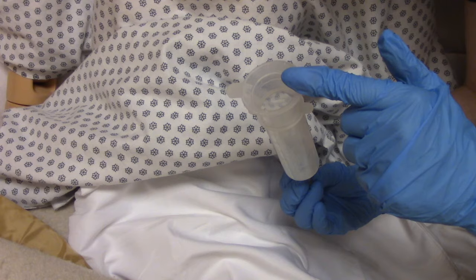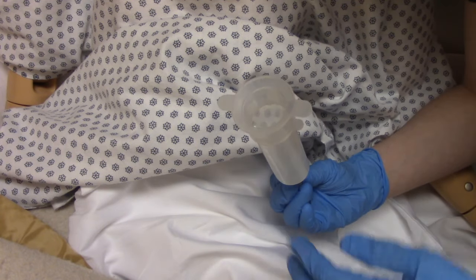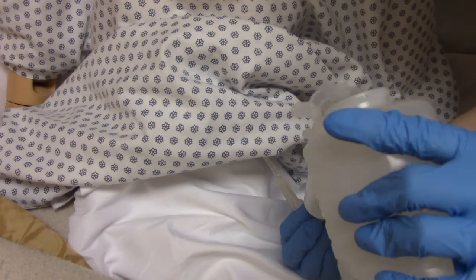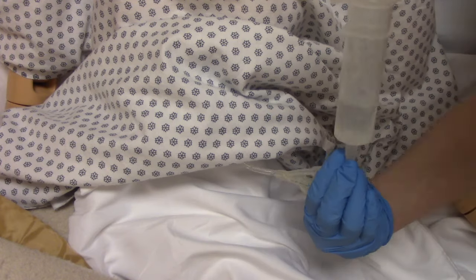If you have multiple medications to give, flush with 10 ml of water in between each one. After giving your final medication, do a final flush with 30 ml of water. After all medications are given, make sure the patient stays sitting up.